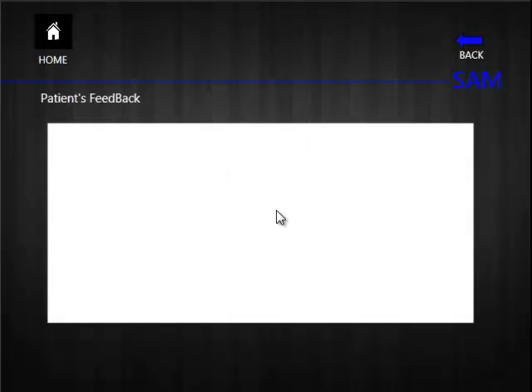The other feature we have here is that when the patient logs into the account, they could view, as I said, logs. All that we'll be looking at a little later. They can view logs, the action plan. Also, they could give feedback to the doctor. The patient or the parent could give their comments to the doctor.